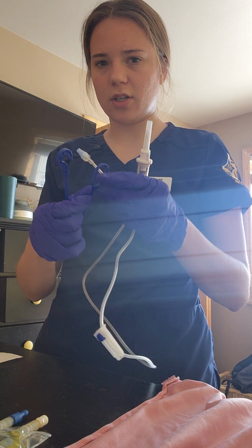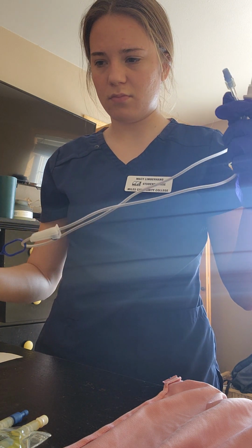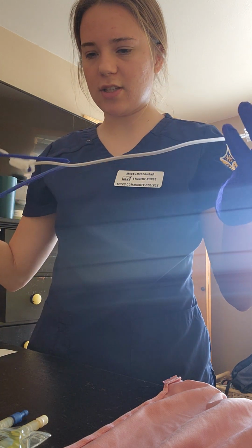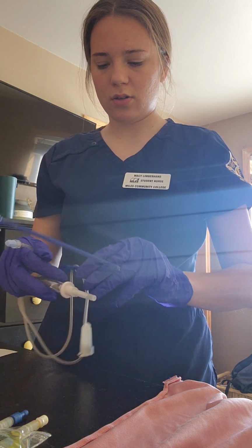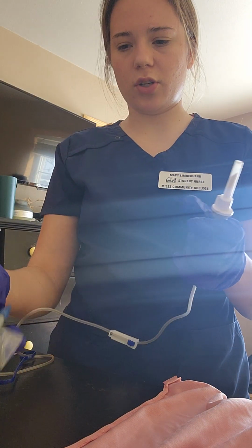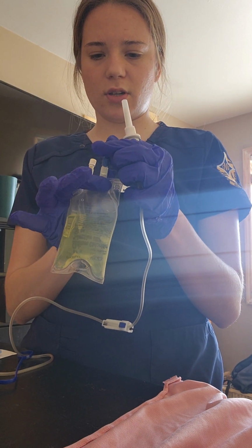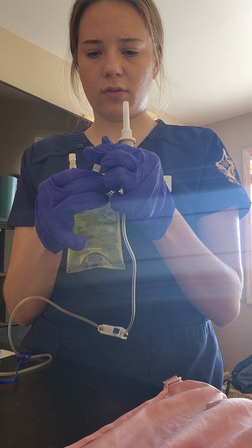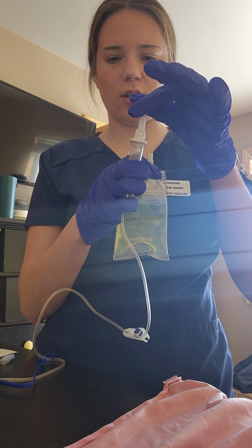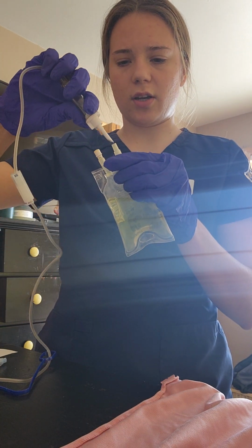I think this goes around here. Maybe. Well, I'll just have that set up. Okay. And now I'm just going to spike my bag. I'm going to pull this off. And then without touching the spike, I'm going to go ahead and spike this bag.